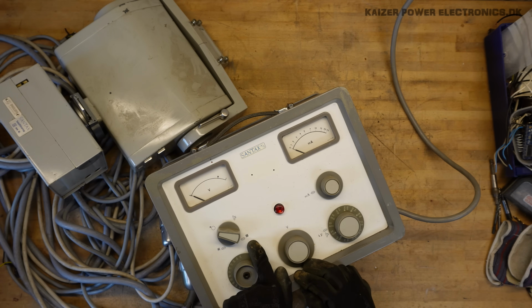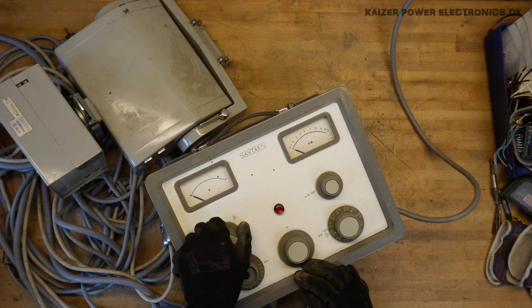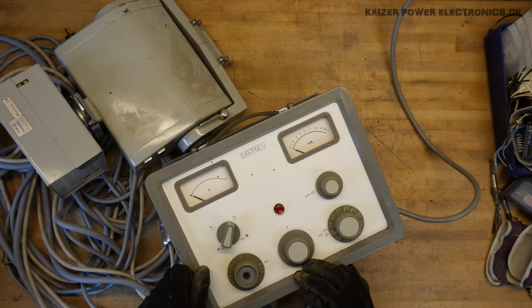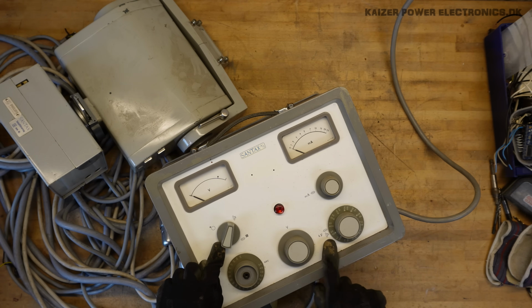The tube inside is a dual focal tube. I'm not sure what this means, maybe off, and yeah, some kind of speaker, or it's also down here. I doubt that's a speaker. That must be something else.